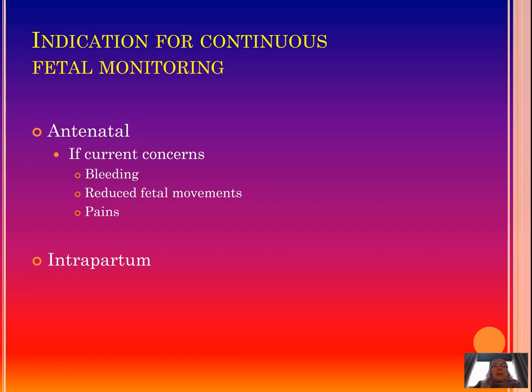It is important that you realize that the CTG is only possible to be used reliably at 28 weeks and more in a pregnancy. Before that, the parasympathetic and sympathetic nervous system of the baby is not fully developed, and this will make CTG appearances different from usual. You might be able to use a CTG, but the interpretation is much more difficult. So what we are going to talk about in this lecture is generally concerned with CTGs that are taken at 28 weeks and later of gestation.